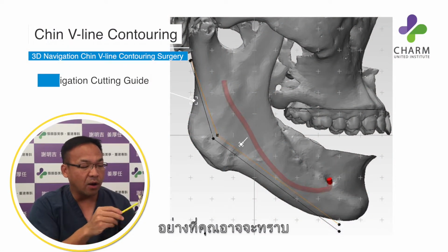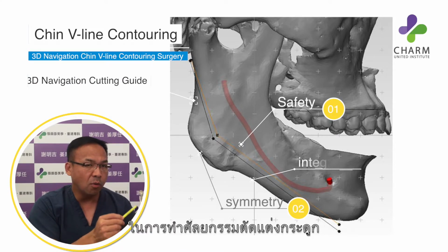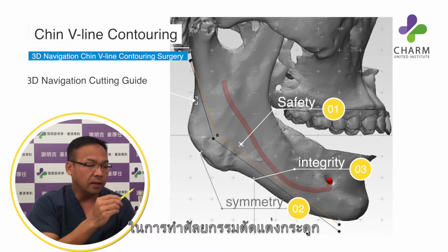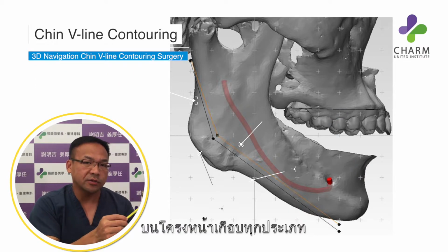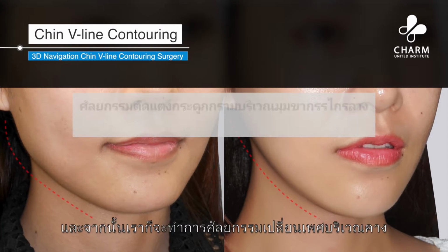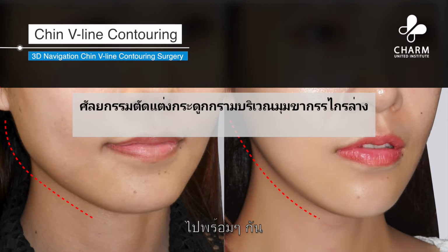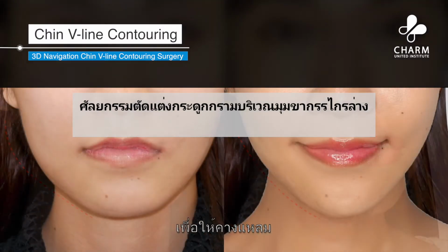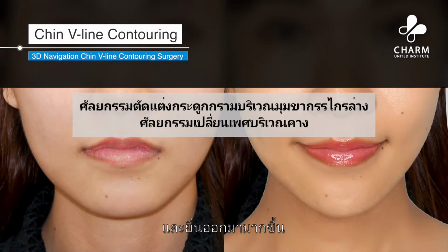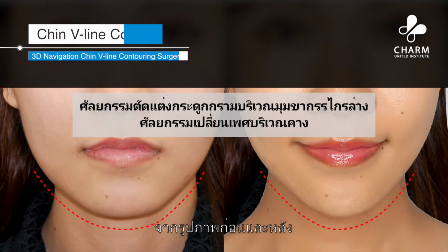As you may know, I always employ a 3D cutting guide in almost every kind of osteotomy on the facial skull. I carry out an osteotomy here, and then we do a chin feminization surgery at the same time to give a more pointed, a more projected chin, which I believe is a more feminized chin. You can check it out in the before and after photos.